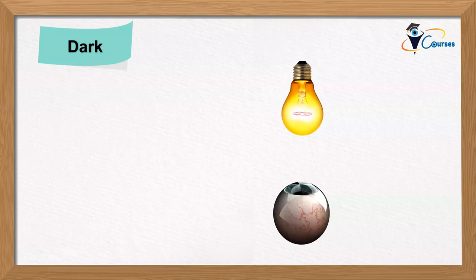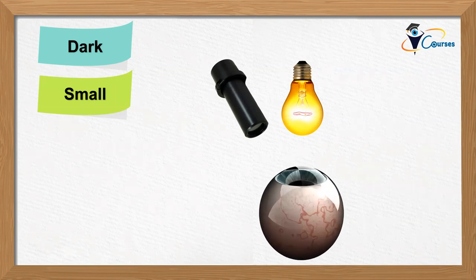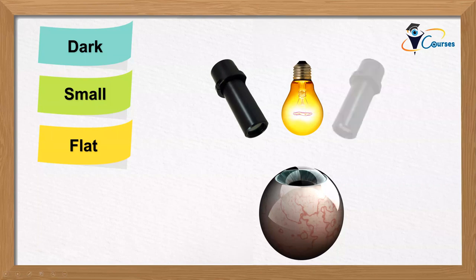What are other problems in visualization of the eye? Well, the eye is a small structure, so we need a larger view of it. So we put a microscope, which will give us a larger view of the eye. Okay, so this is the second thing. The third thing: the eye looks flat because I'm viewing with only one microscope, with a single eye, so I can't appreciate depth perception. And the eye has different structures present in layers: cornea, then anterior chamber, then the iris. So I need depth perception. So we put another microscope, so you can see with both eyes instead of one.